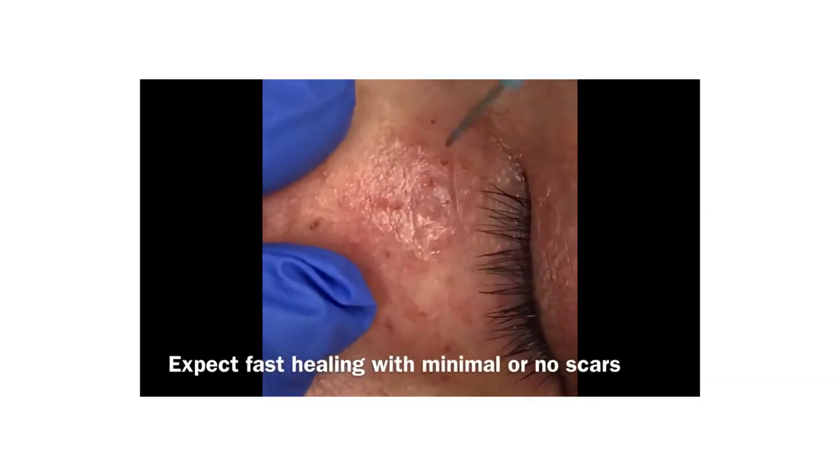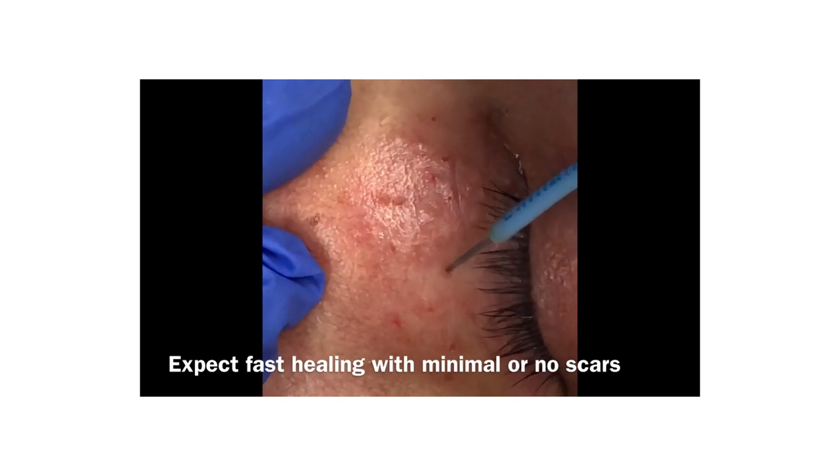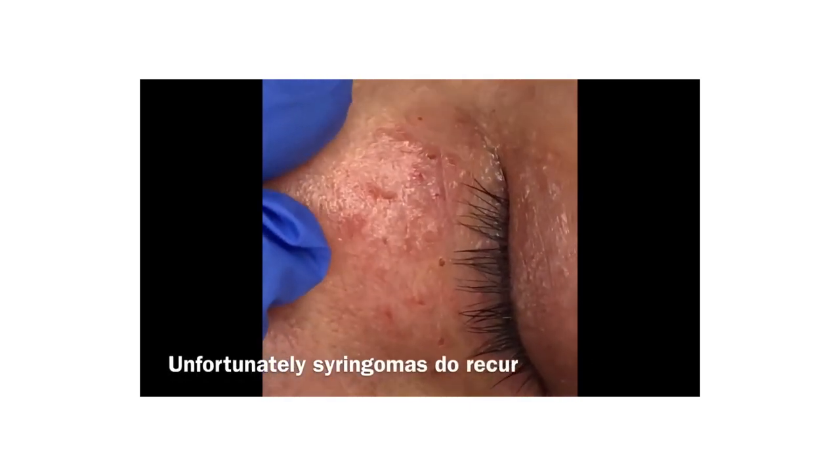Surgeatron is an ideal device for removal of syringomas. The pointed needle tip ensures precision ablation of each small lesion.